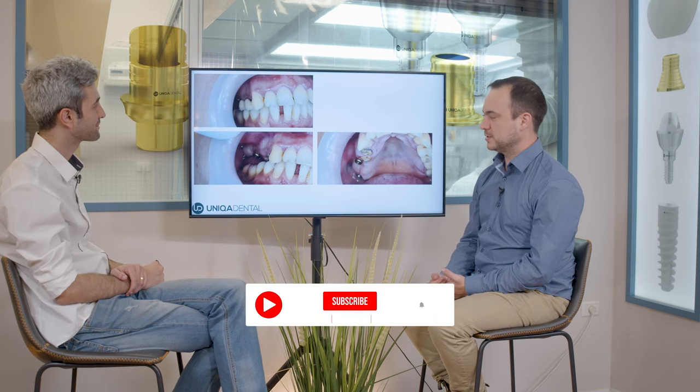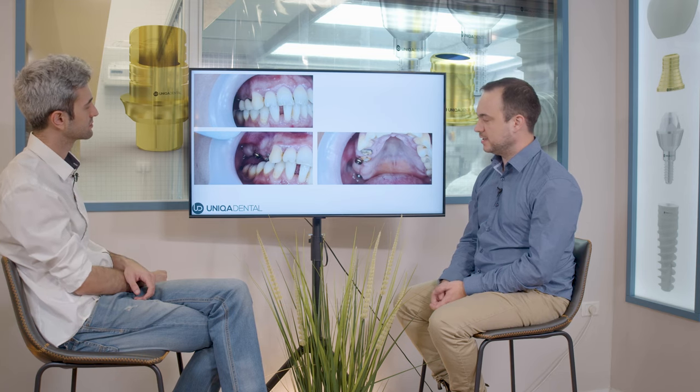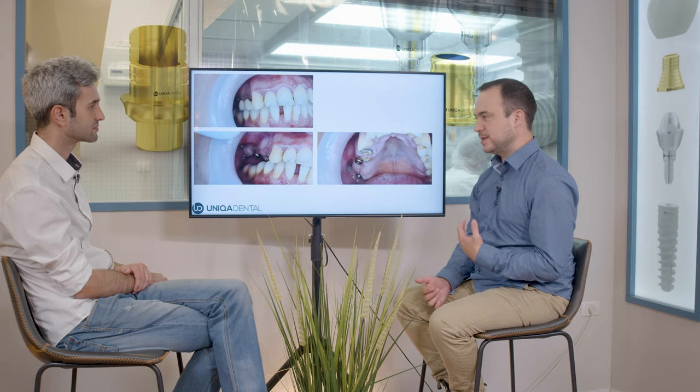Today we want to show a case where we had a patient with a bridge on a couple of implants, and the patient had two crowns on two teeth. The teeth had extensive caries and we needed to extract the teeth. There is an implant here and those are the teeth beneath those crowns. We changed the teeth to a bridge with immediate loading, and the most important thing we want to show is how we did that and the considerations we had throughout this procedure.